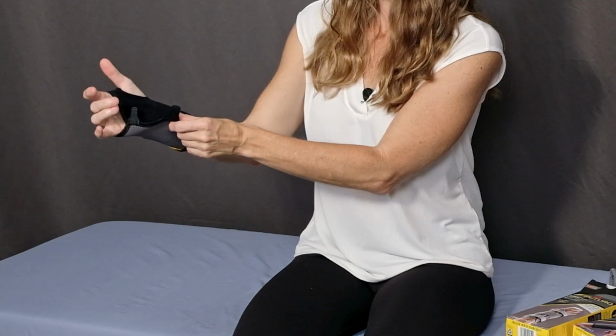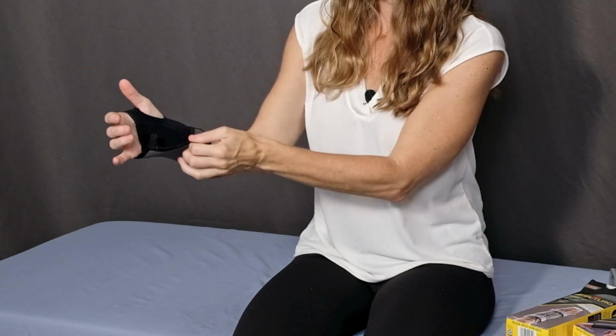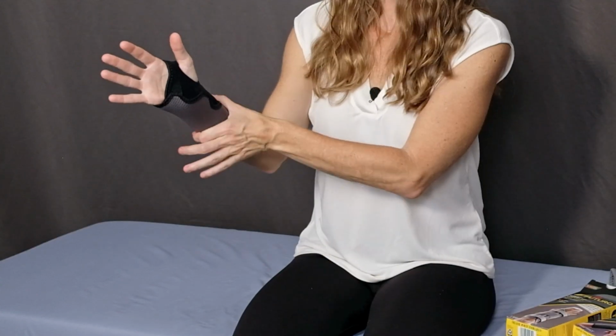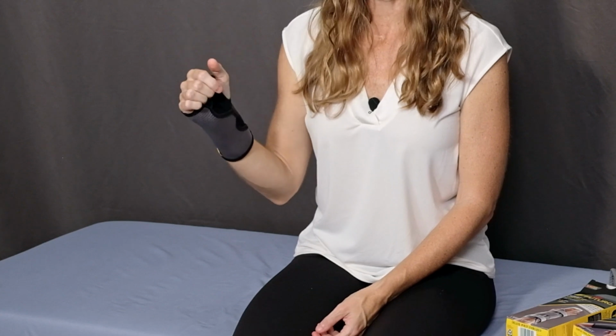And I'll show you how I know that once I put it on, you'll see. So I'm going to slide my hand through the sleeve, put my thumb right through that hole there. So I know this is meant for the right hand because the stay curves in toward my palm. If I tried to put it on the left hand, then the stay would poke out of my hand, and that's not the way it should fit. It should match the curve of your wrist. Okay, now in this position, I'll close the Velcro. All right, again, close them so that you have a snug but not tight fit.